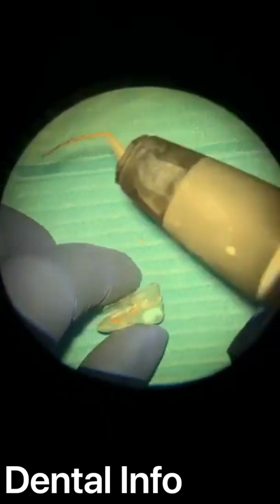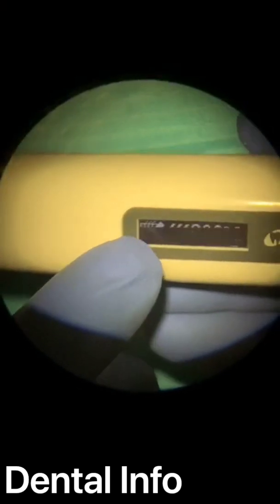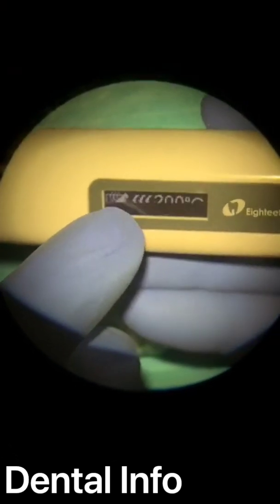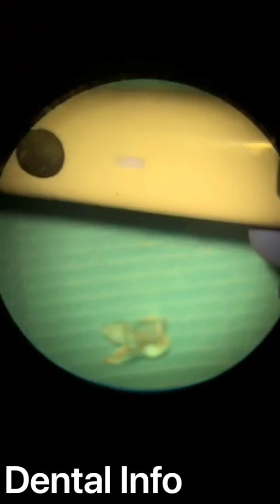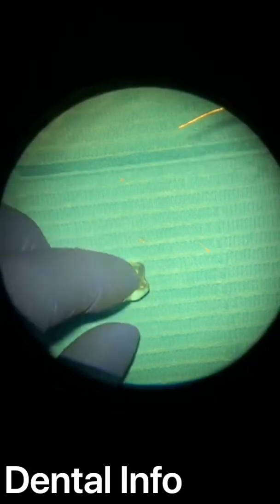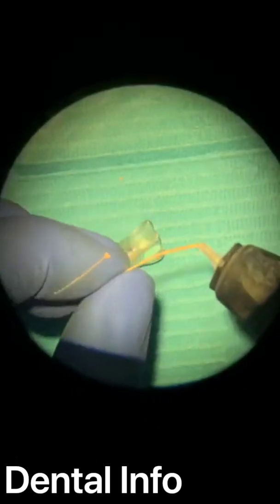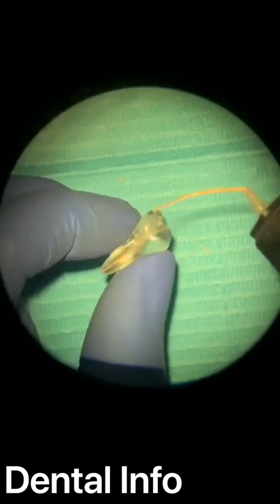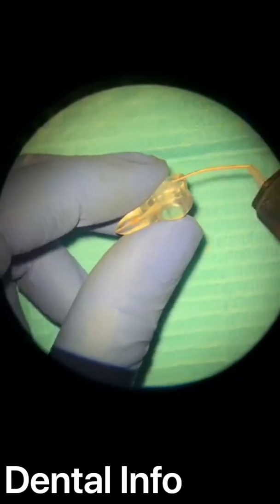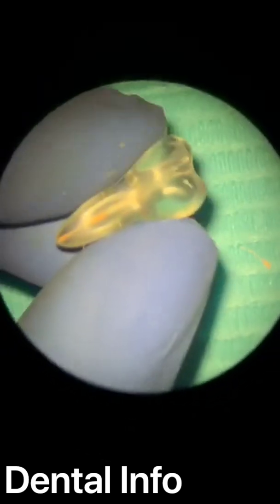and with good speed. Plus, here you can set up your favorable speed. You want the tip to give you the gutta percha quickly, medium, or very fast. I'm always using the middle option. I want my gutta percha to come out not too quickly. So I will magnify here for you.